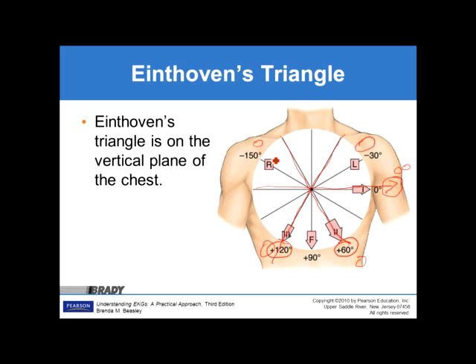Now, all of these that I'm fixing to circle here, AVR, AVL, and AVF, are the augmented voltage leads. So how the computer figures those is after all three bipolar leads are present, it actually puts a center ground where all of the lines intersect. And from that, we'll look at entire regions. An example of this, whenever it's looking at augmented voltage left, it changes the polarity of things to where it's looking from this direction and this perspective.